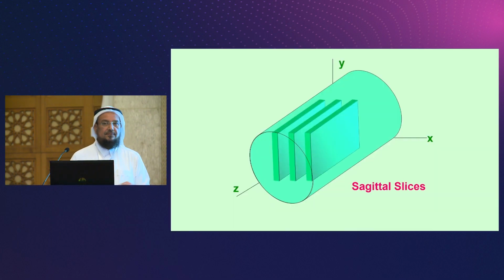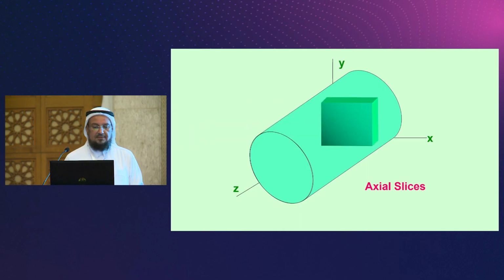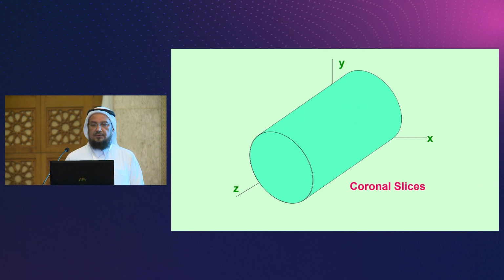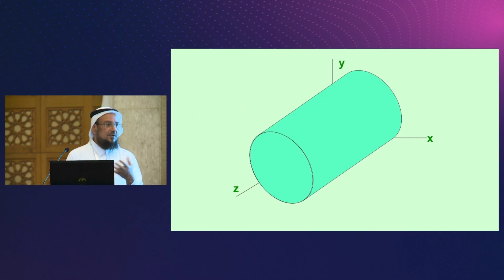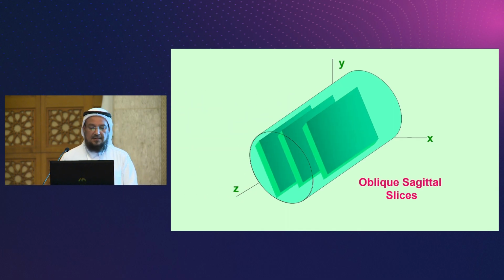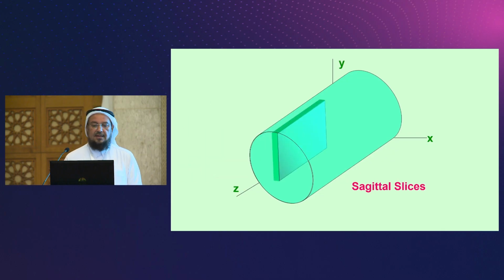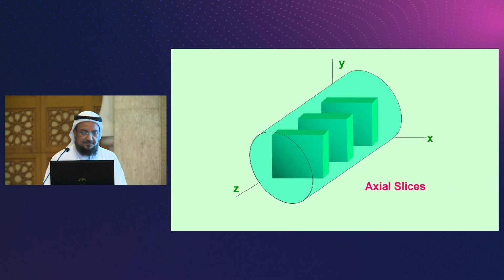Again, slice selection is very helpful in MRI because it can allocate a slice to be, for example, axial, sagittal, or coronal. The first gradient is called the slice selective gradient. The other two will be one used for frequency and the other for phase. I can swap between them to select sagittal, axial, coronal, or even oblique slices, which can be acquired by applying two gradients at the same time. So I can, for example, send 50% of the current to the X and 15% to the Y. By that, we will be able to acquire oblique slices.